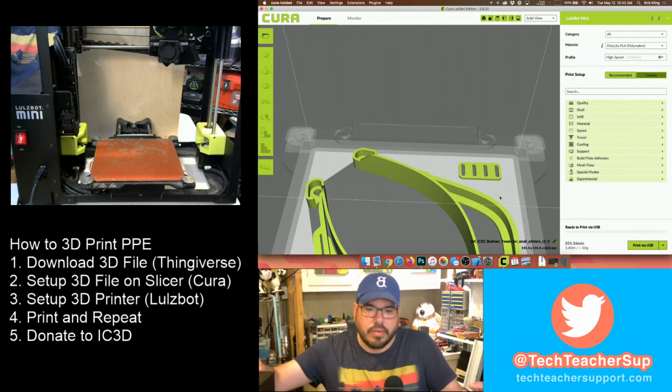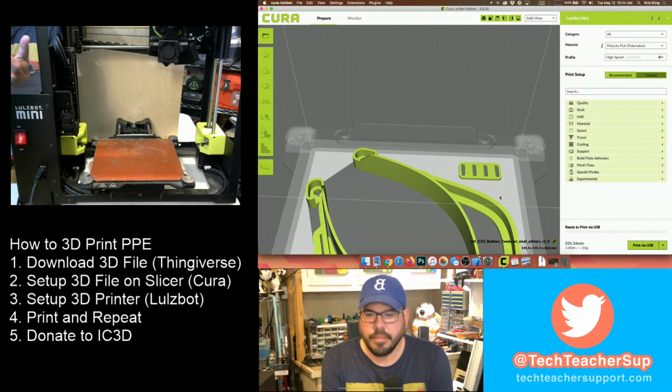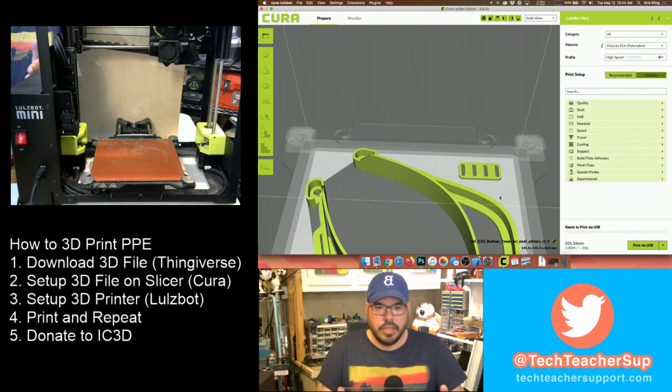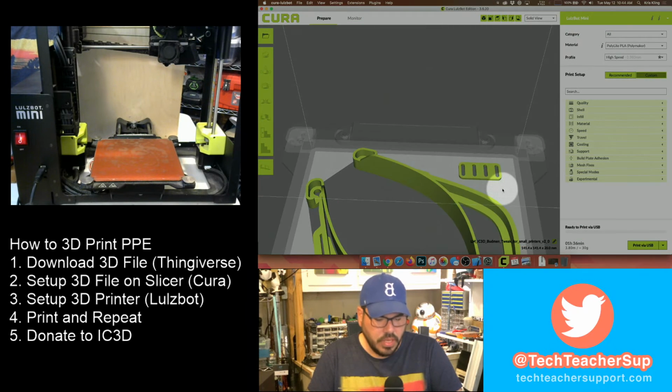It takes about 2 hours. You could knock out 12 of these a day, depending on how much you're around your printer, or at least one a day or two a day. And then you can donate these to IC3D. So here we go. We are going to hit print. It's going to take off. So if you follow my mouse here down in the corner, I'm going to hit print via USB.